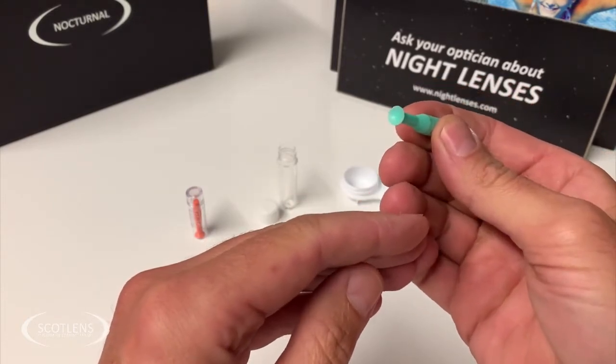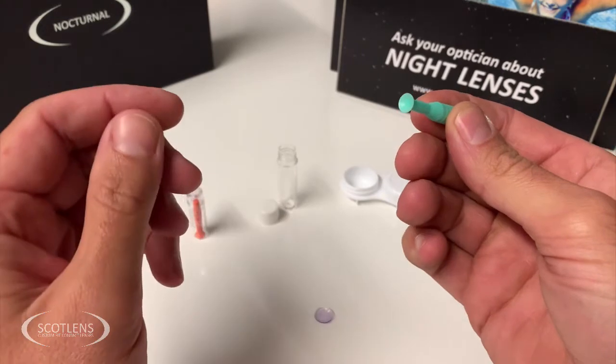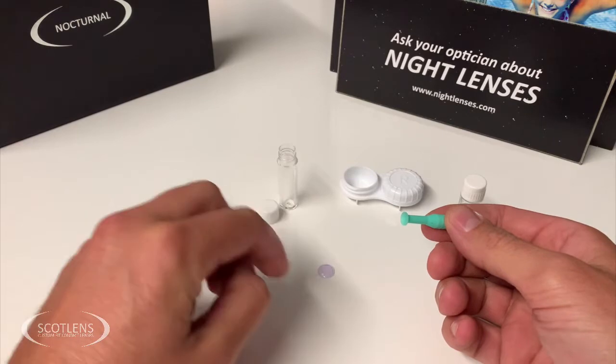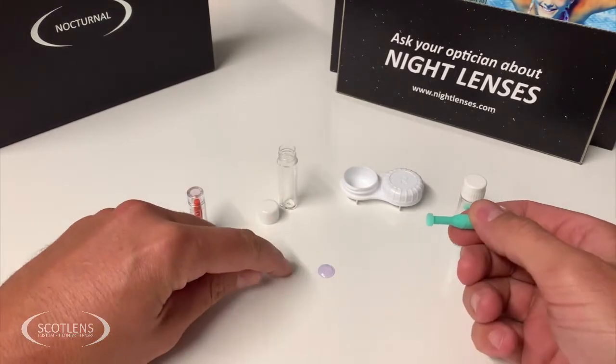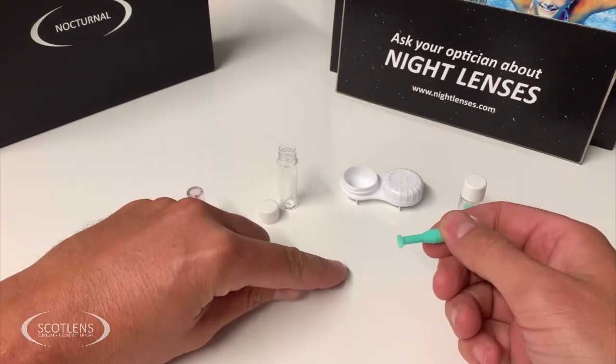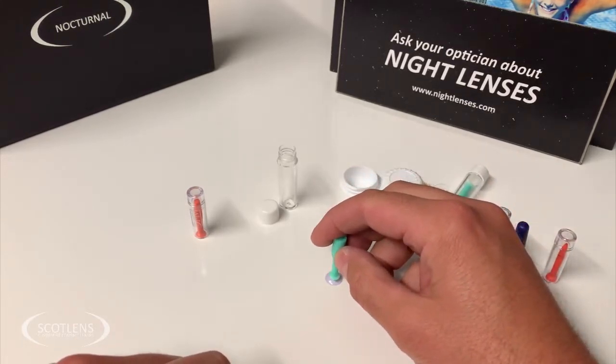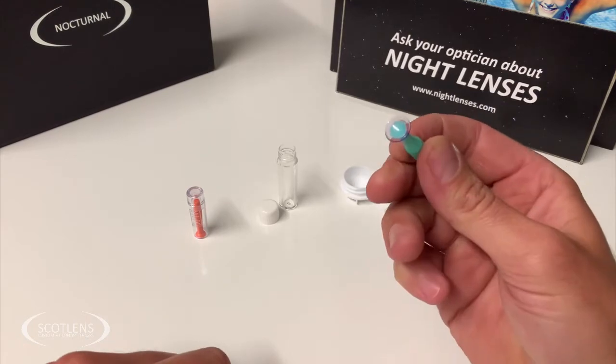But the suckers can be handy, especially at the start when patients are learning to handle lenses and may well drop them on a flat surface. If you try to pick the lens up by squishing it you can damage it, so the sucker can be used to very gently pick the lens up.